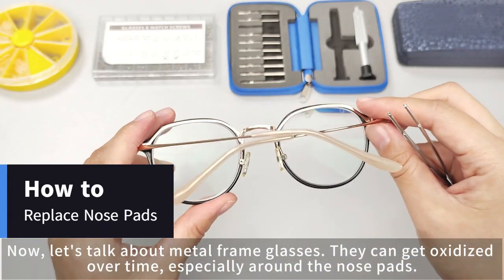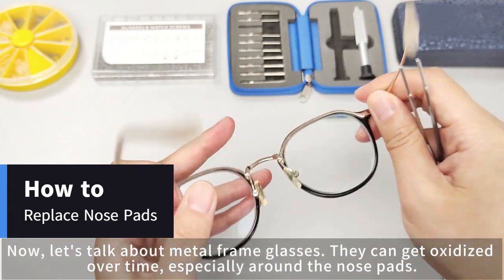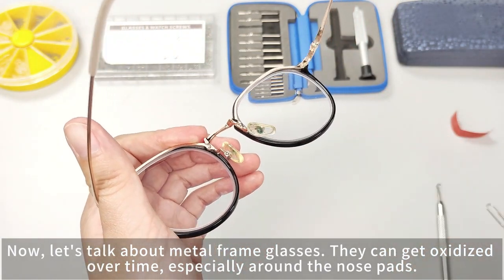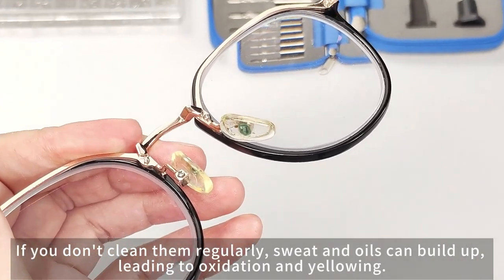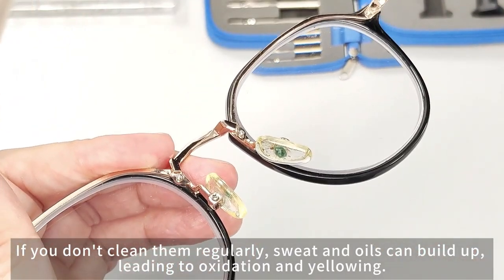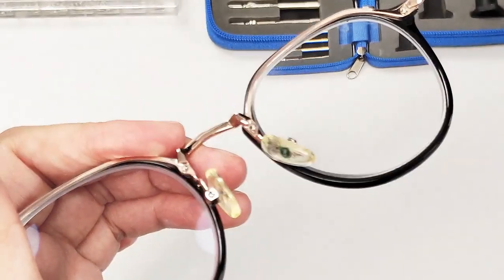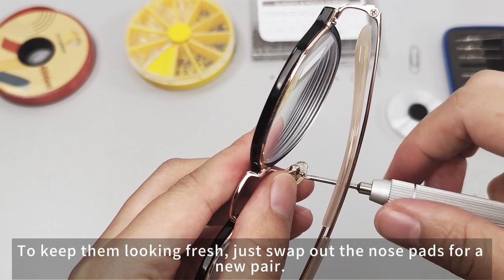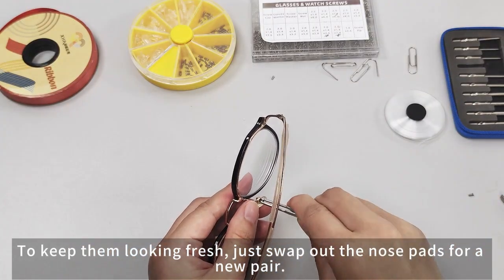Now, let's talk about metal frame glasses. They can get oxidized over time, especially around the nose pads. If you don't clean them regularly, sweat and oils can build up, leading to oxidation and yellowing. To keep them looking fresh, just swap out the nose pads for a new pair.